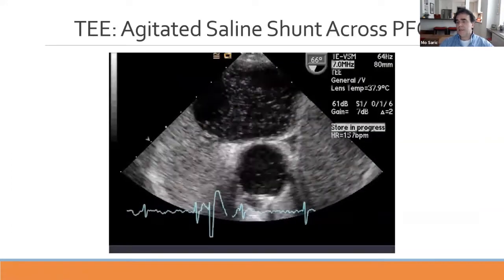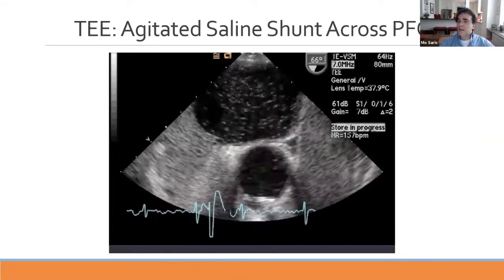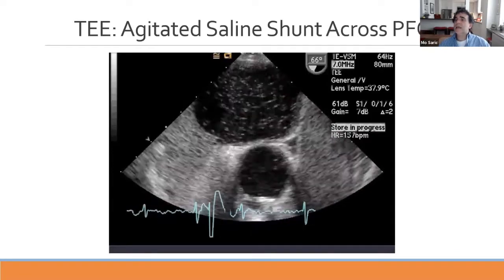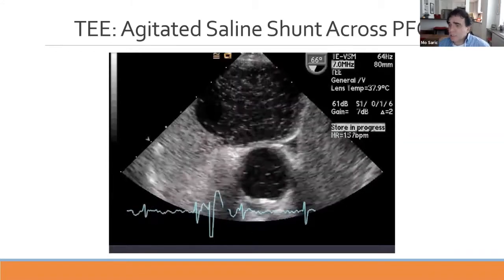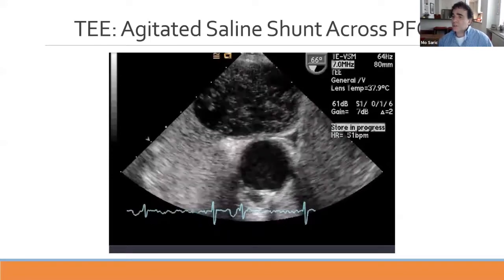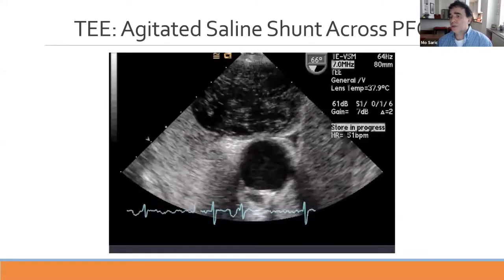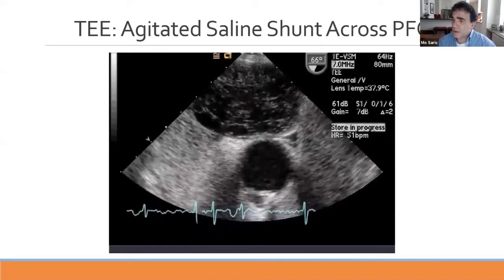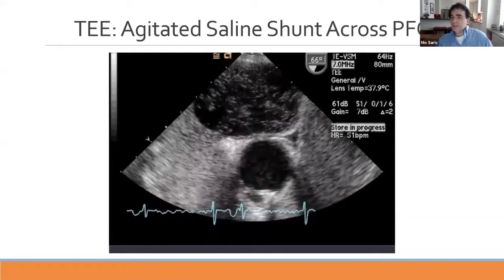Notice that the bubbles across the PFO occur in puffs—there is only a transient increase in right atrial pressure over left atrial pressure, which allows intermittent boluses of contrast to cross the patent foramen ovale. So PFO is characterized not only by early appearance, but by this bolus-like, intermittent flow pattern across the patent foramen ovale.